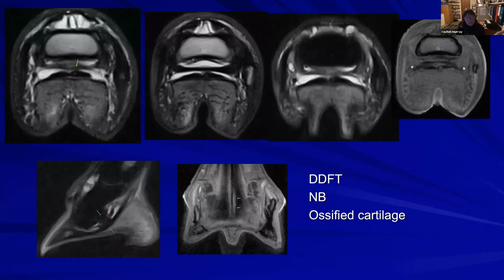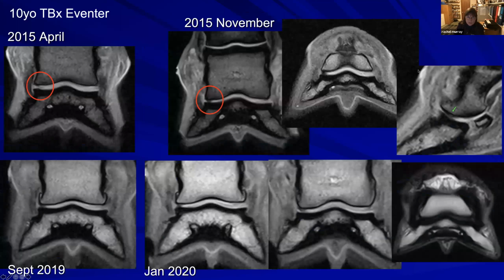Now, this horse with our articular cartilage injury was MRI'd because he became lame at a subsequent point, and had a deep digital flexor tendon injury. So I thought we might follow that instead. So we've got a deep digital flexor tendon injury here, which is high signal intensity on T2 fast spin echo, involves the dorsal margin, high signal intensity on STIR images, and high signal intensity over a larger area on T1 images.